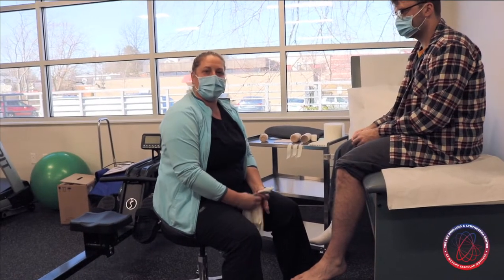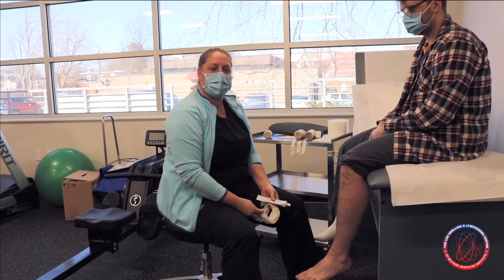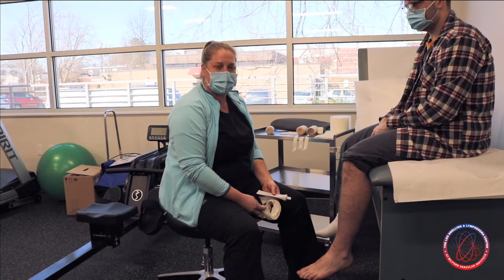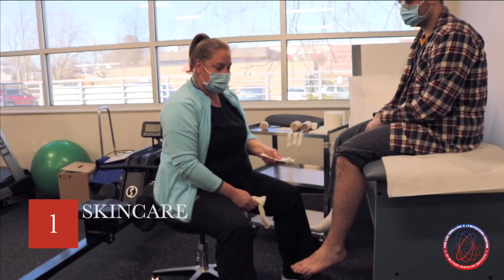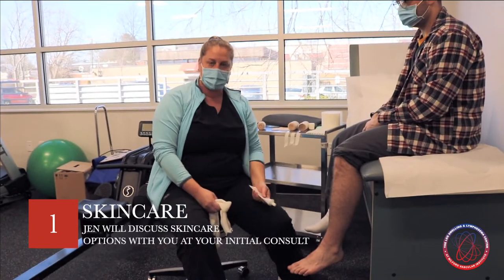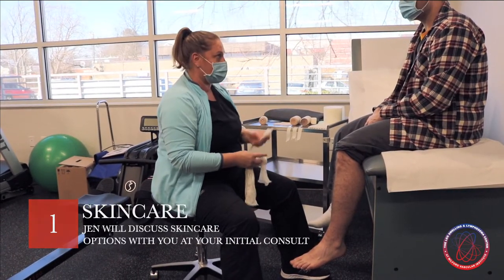Hi, I'm Jen. I'm a certified lymphedema therapist at Milford Vascular Institute and today we're going to go over how to self-bandage for your lymphedema. So always remember skin care first — make sure you wash and dry your skin thoroughly and apply your moisturizer before putting your bandaging on.